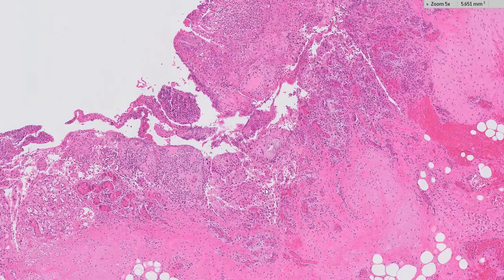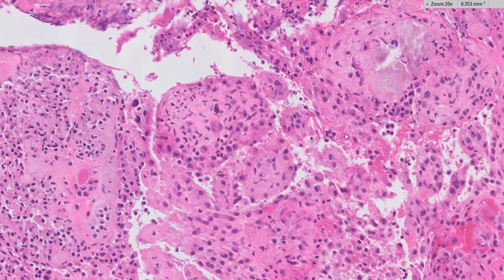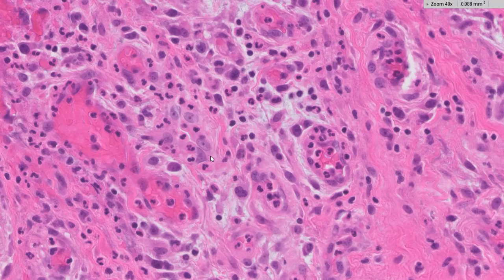So diagnosis number 1 was very easy. There's sheets and sheets of neutrophils in here. Let me find them for you. There you go. And as I showed you earlier, there were even more neutrophils. This is infection, and the criteria for infection are listed here.